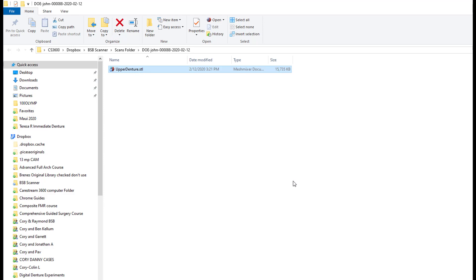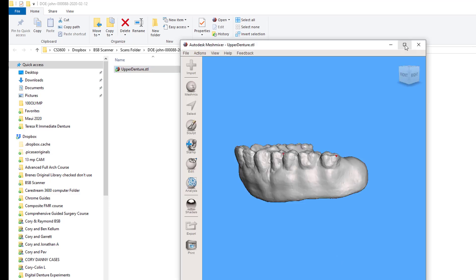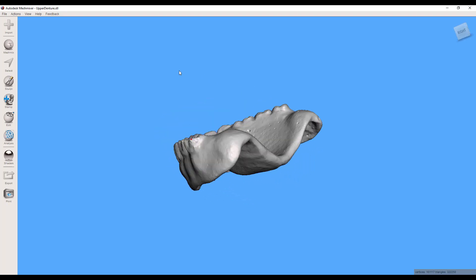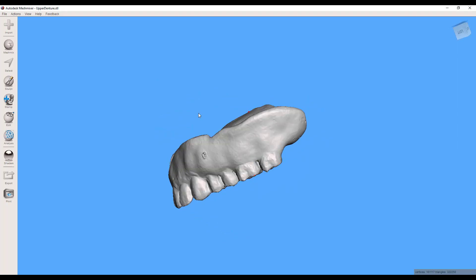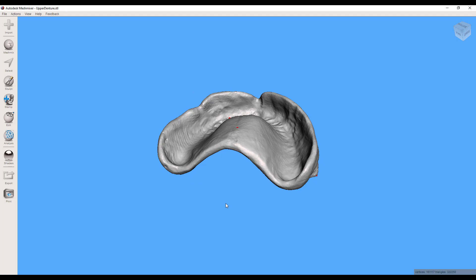If I was to open that, and here's the final STL. And so you can see a very accurate representation of that denture.